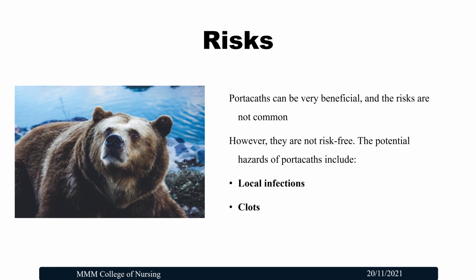Risks. Portacaths can be very beneficial and the risks are not common. However, they are not risk-free. The potential hazards of Portacath include local infection and clots. Local infection. The skin around the insertion site could become infected and need antibiotics. Clots. If a clot develops in or around a Portacath, doctors use blood thinners to remove it.